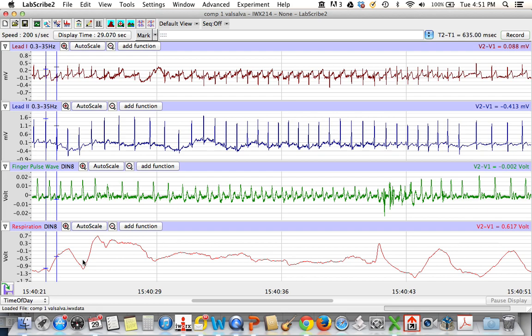I'm going to need to be able to slow down a little bit, and so they'll change the heart rate accordingly. And then what happens is it accelerates, and then we see the different types of changes that occur after you have the release of the pressure. Release of the pressure causes a moment of increased firing, and then an increase in your heart rate, and then finally the heart rate slows down quite a bit as the blood starts to reach your baroreceptors in your aorta.